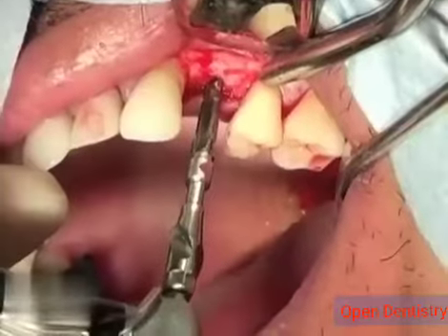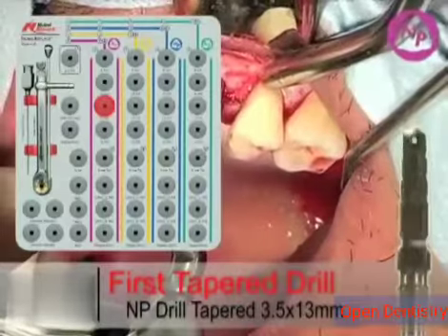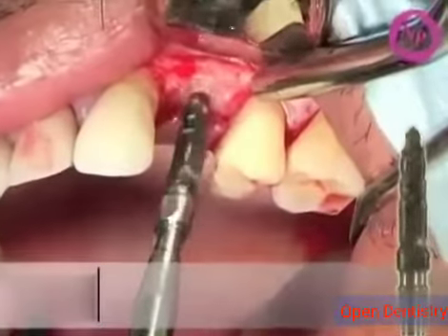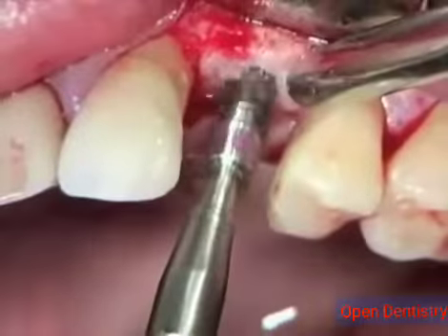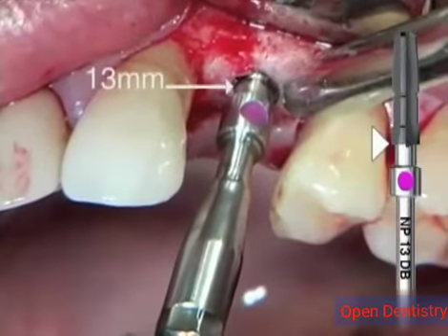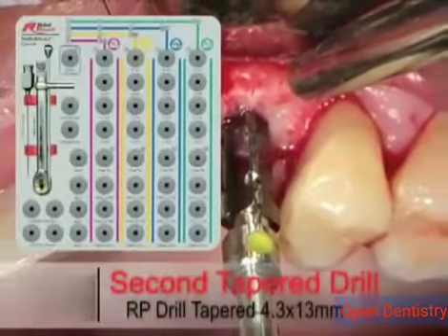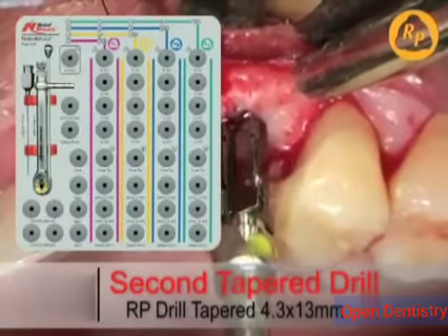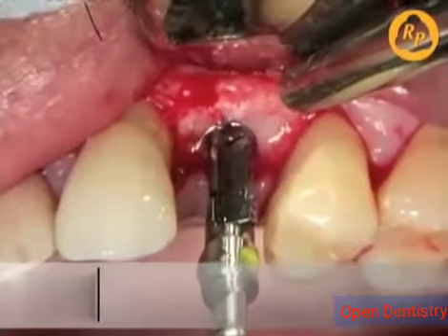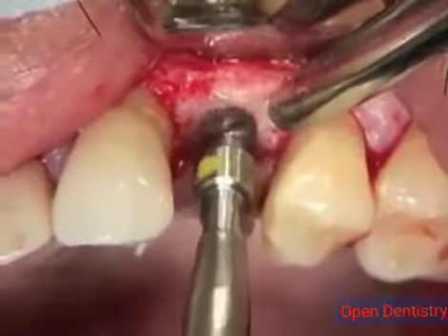The next drill is a narrow platform taper drill, 3.5 by 13, which is put into position to final depth, where you can see here the final depth to be 13 millimeters for the next implant placement. The regular platform taper drill used here is 13 millimeters, which is guided into final position, again at the crest of bone.